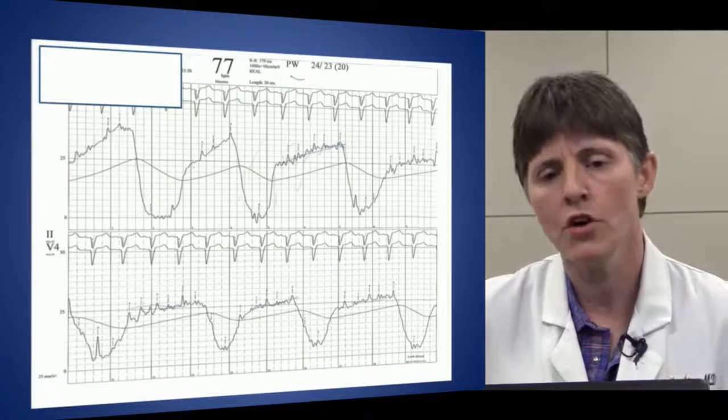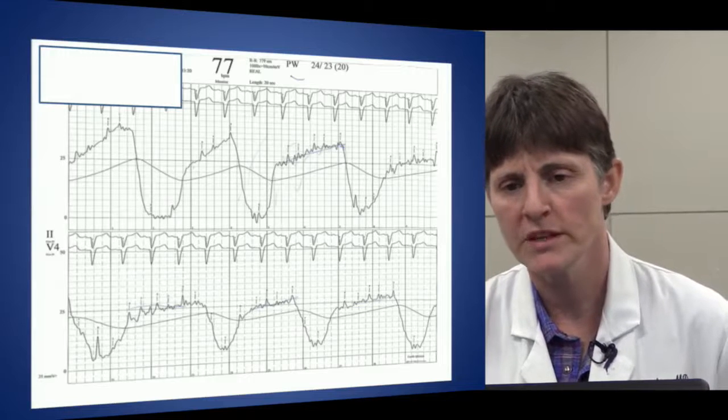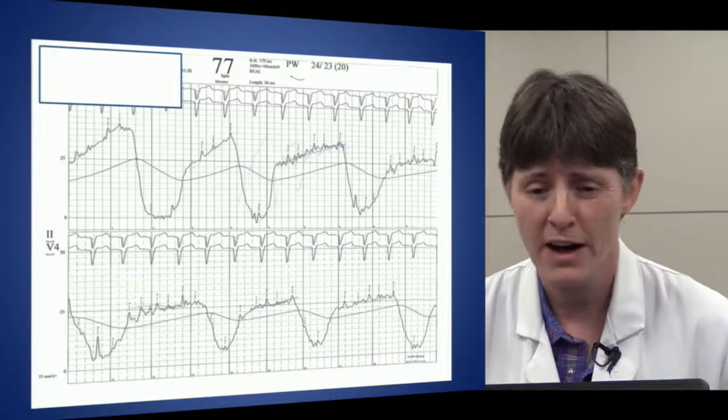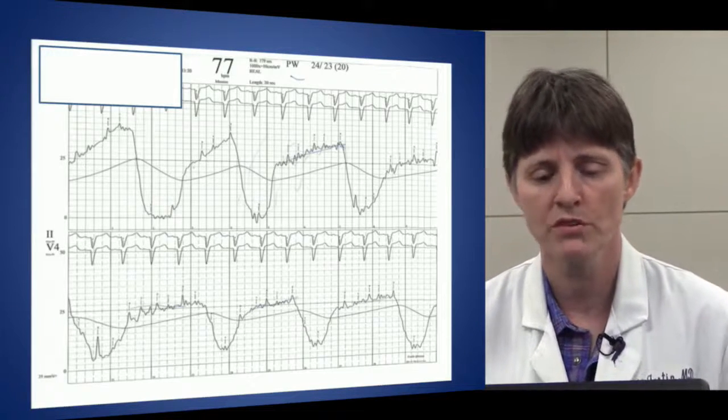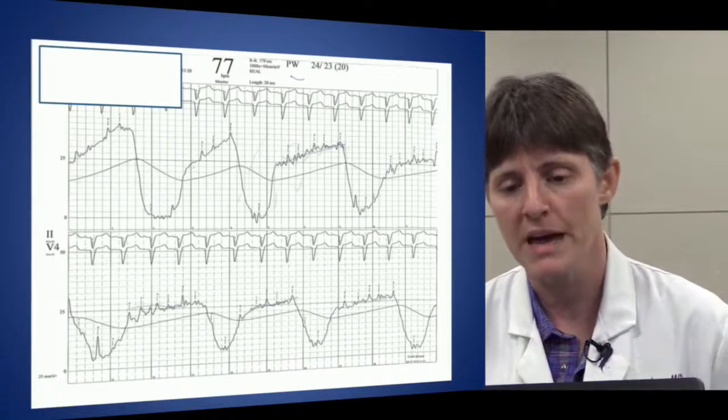It's important here to know what you're picking for the wedge, because there's a big difference between saying somebody's wedge is 35, or if you pick the bottom of those inspiratory dips, you'd be saying the wedge is 5 or 10, and that would be absolutely wrong.